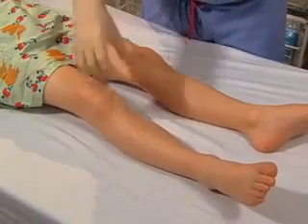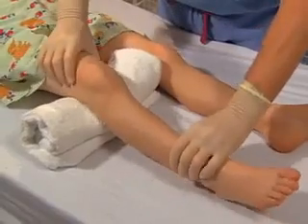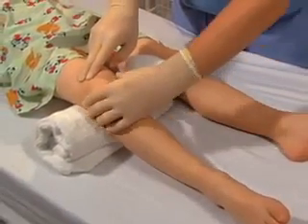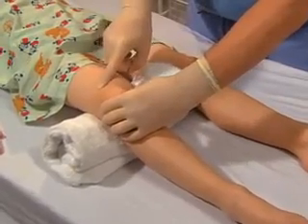To relax the quadriceps, flex the hip and knee slightly with a towel roll. The distal femoral insertion site is in the midline, just 1 to 3 centimeters proximal to the palpable epicondyles of the distal femur.